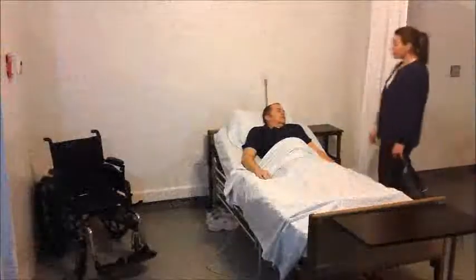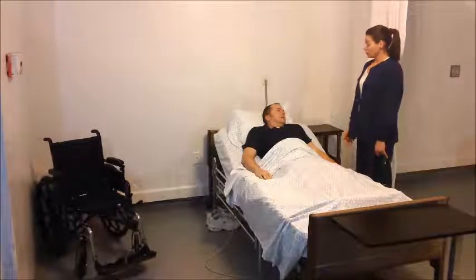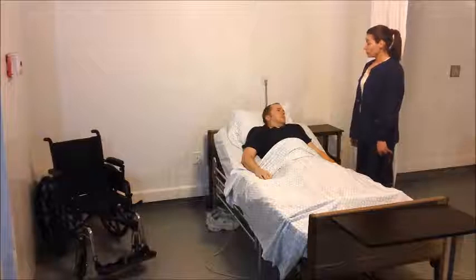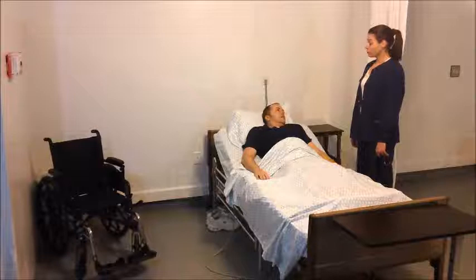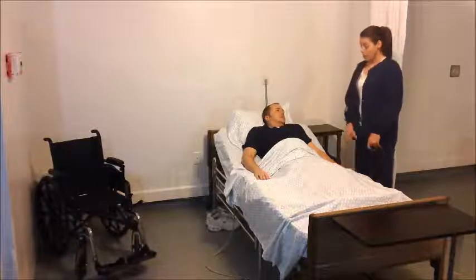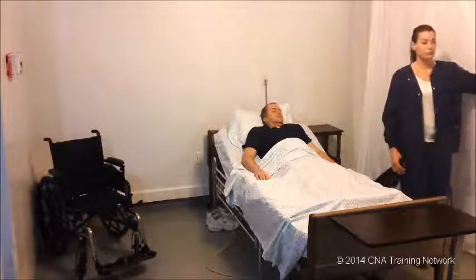Greet the client, address them by name, and introduce yourself. Explain the procedure by speaking clearly, slowly, and directly, maintaining face-to-face contact whenever possible, and ask the client about personal preferences. Provide privacy with a curtain, screen, or door.